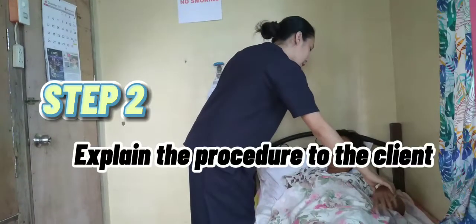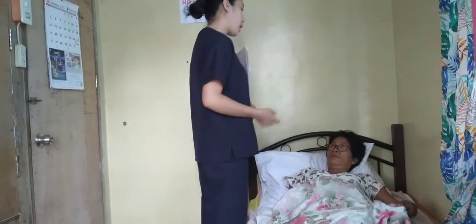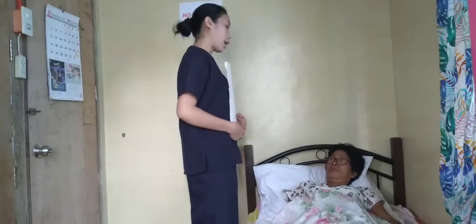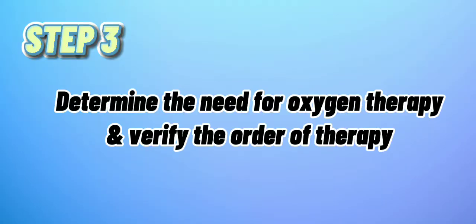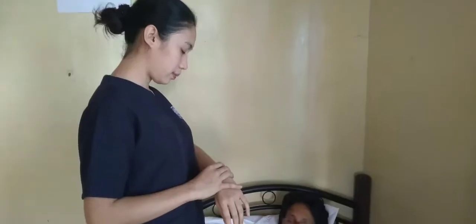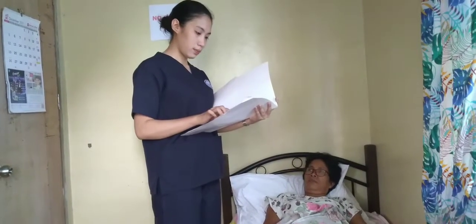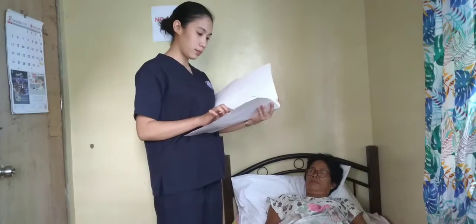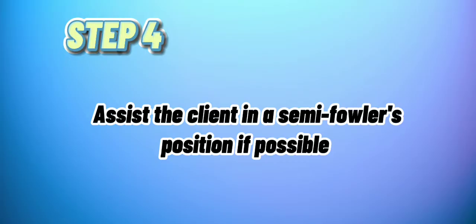Step number two: explain the procedure to the client. Step number three: determine the need for oxygen therapy and verify the order of therapy. Respiratory assessment is done to determine the need for oxygen therapy and to develop baseline data. We have to verify the doctor's order, as we cannot administer oxygen without the doctor's order except in cases of emergency.